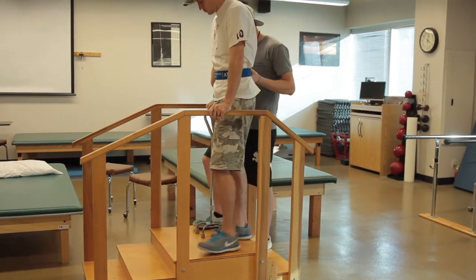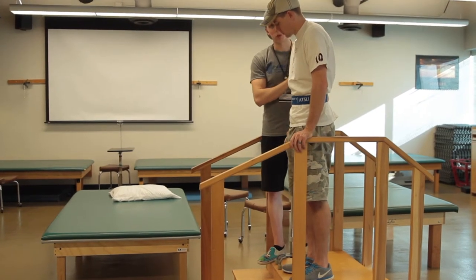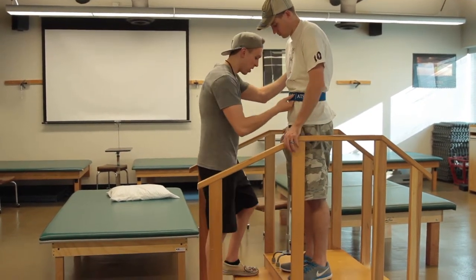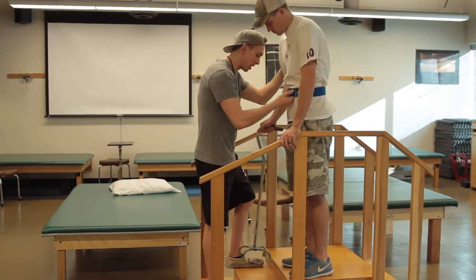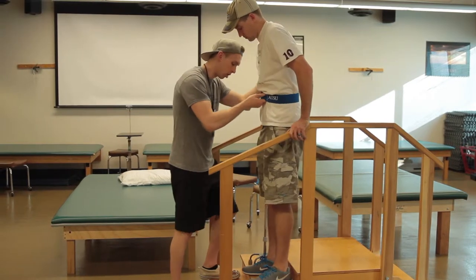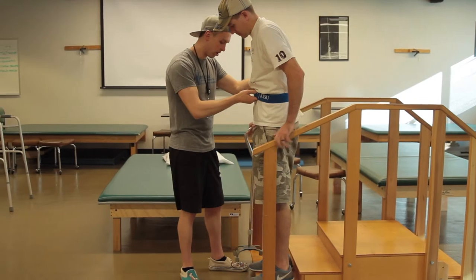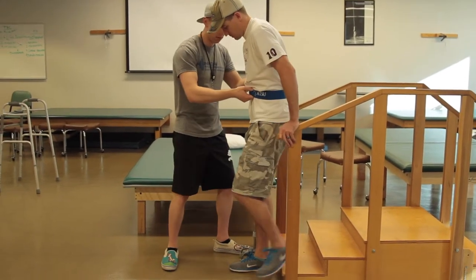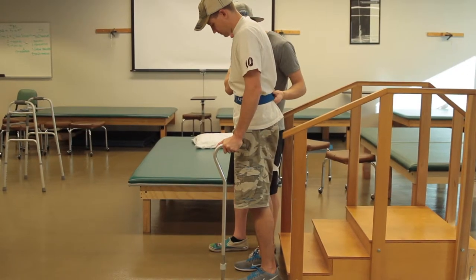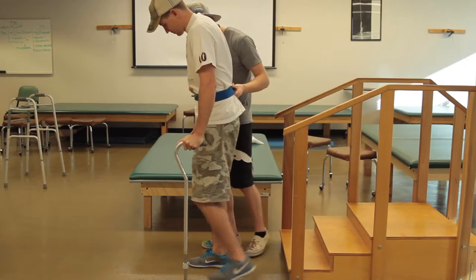Good. We'll go over here to the side. Now I'm actually going to switch in front of you, make sure that we're safe that way. Okay, so you're going to go this time cane first and down with that right, and then left. Good. Very good. Perfect. And we'll switch back. Good. Cane goes in that leg, and we can carry on our way with that right leg first after the cane.